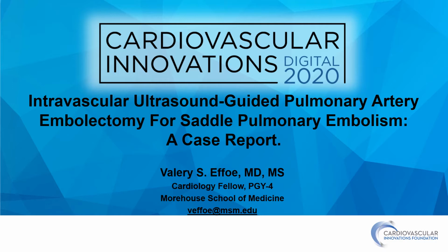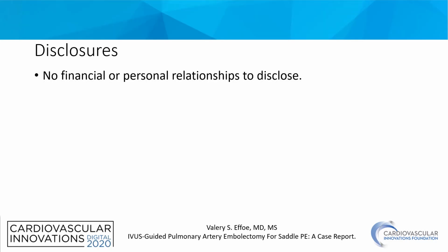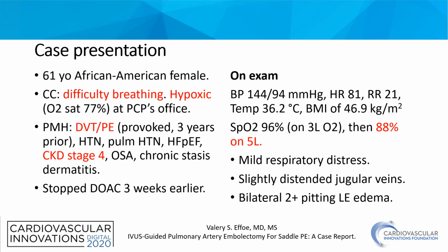Today, I'll be presenting a case related to the use of intravascular ultrasound in pulmonary embolectomy for saddle pulmonary embolism. I have no relevant disclosures for this presentation.